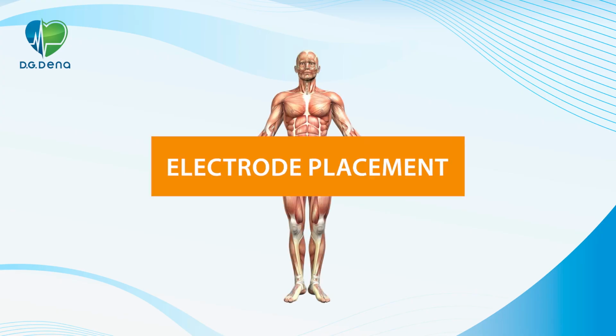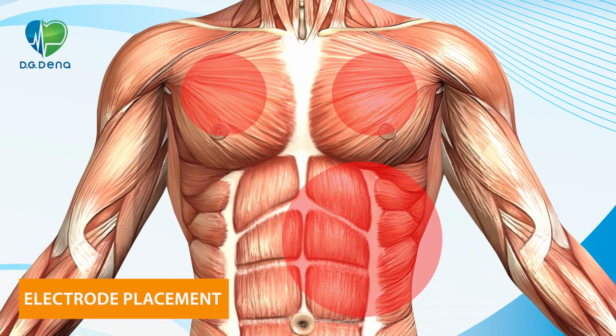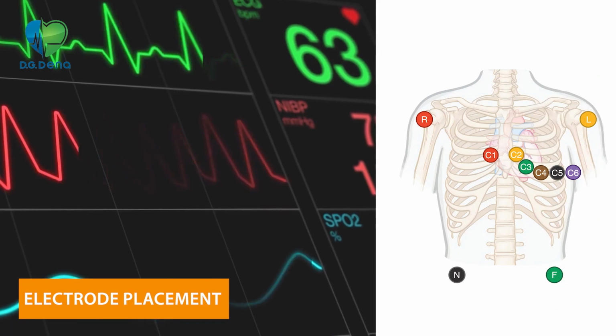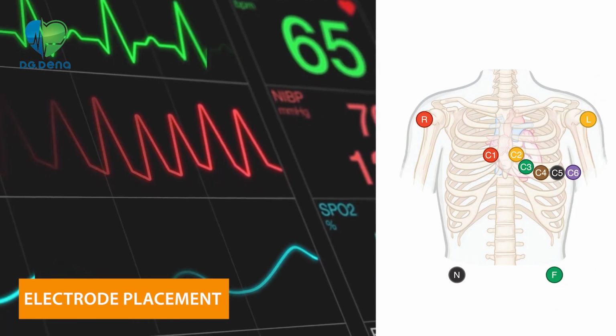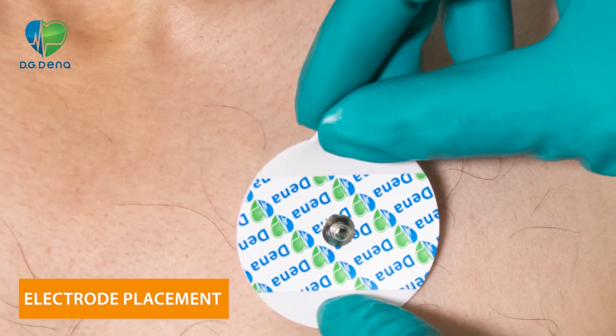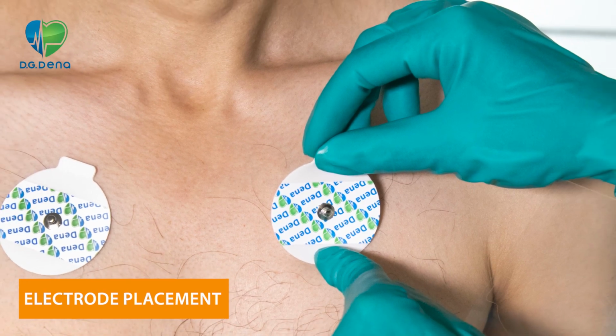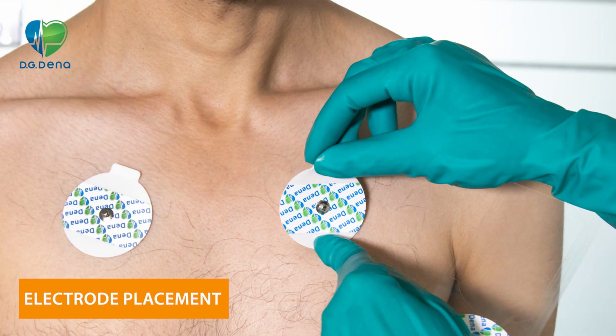Electrode placement. The first step is determining the correct site for chest electrode placement. Proper electrode positioning on the patient's body can significantly impact achieving optimal results. Select a site without bony prominences to maximize conductivity and avoid areas with large muscle mass to minimize muscle interference.